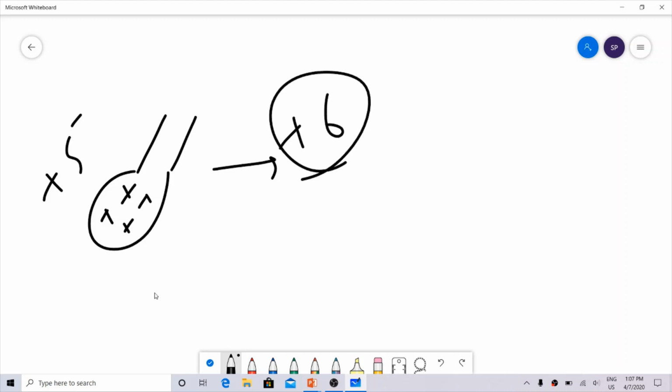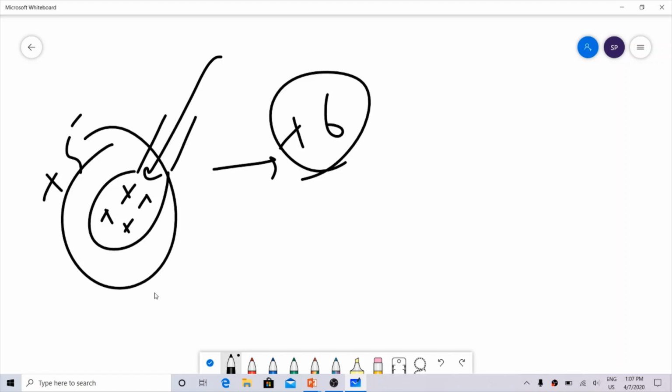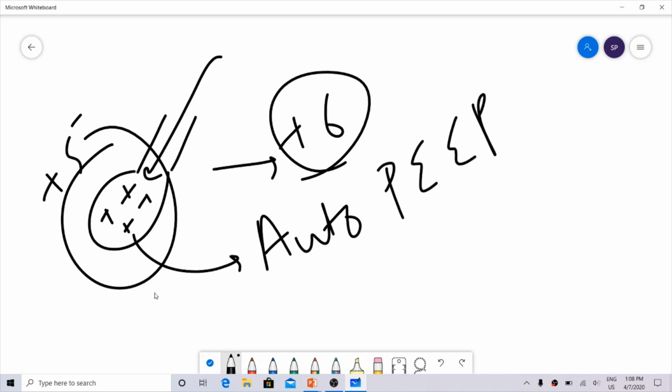So normally you don't require this, because in a normal patient all this air goes out, so there is hardly any pressure, very minimal pressure. But in these patients it is high, so they need more inspiratory effort to get air inside. Only then can gas exchange occur, only then can the air move in. Even after exhalation this pressure remains, and it happens automatically, and it is an end expiratory pressure, so that is why it is known as auto PEEP.